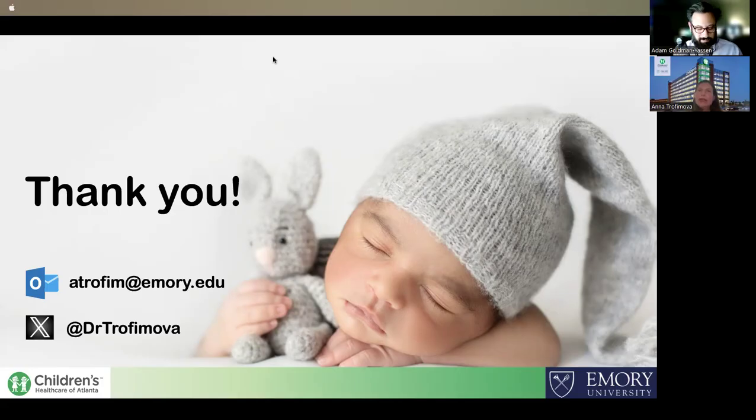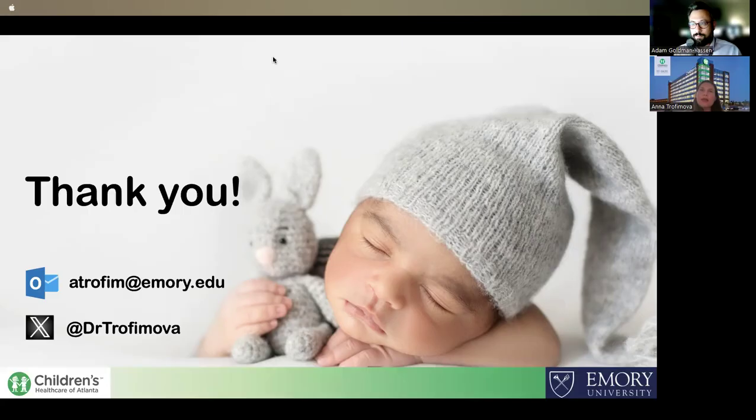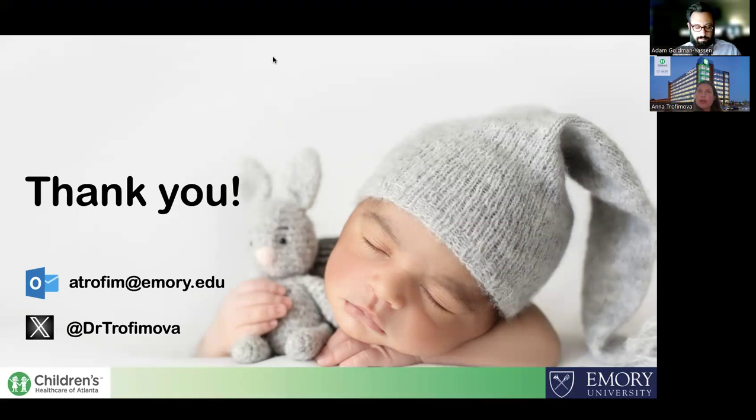I would say that in the majority of cases, I do not put a disclaimer. I just usually read it the way it is. If that brain MRI looks completely normal, I just read it as a completely normal MRI. I may only put a disclaimer in cases where there is a very significant discrepancy between clinical history and MRI. For example, if they have a history of really severe hypoxia, some kind of really extensive event during delivery, and they have a very high clinical concern, and clinically the baby is not acting normally, but the MRI looks completely normal.